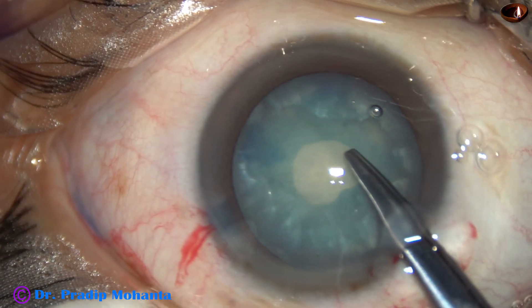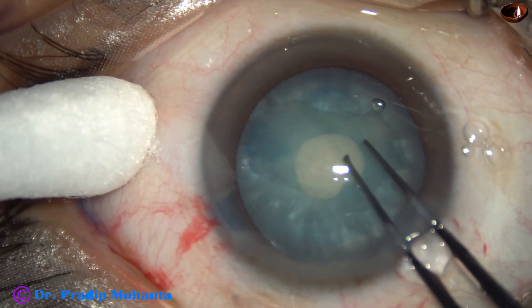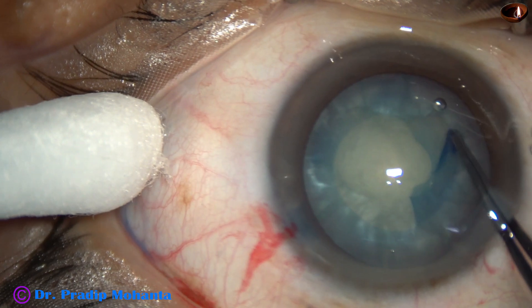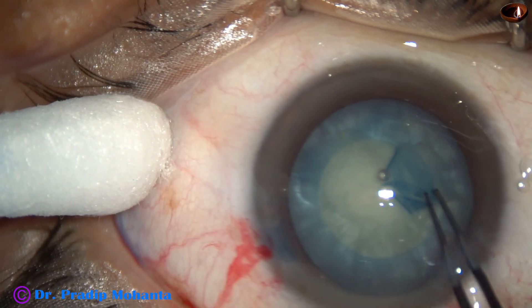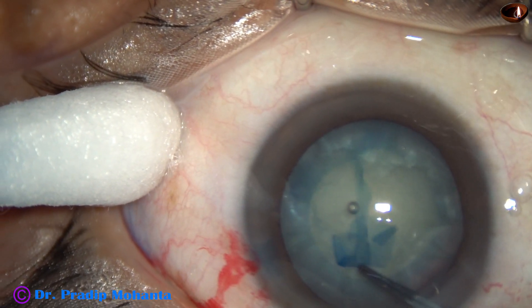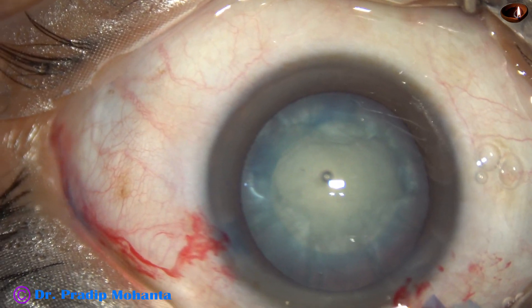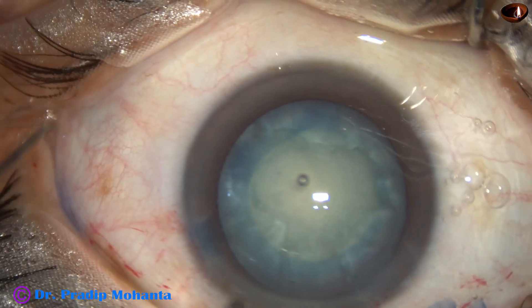A Vannas scissors is taken. A small cut is given at the margin of the small rexis, and now very carefully a 5mm capsulorhexis is done. I want the optic of the intraocular lens to be overlapped by the anterior capsular rim, so the size of the rexis is about 5mm. This has been a very satisfactory rexis. This control was achieved because of the reduction of intralenticular pressure.